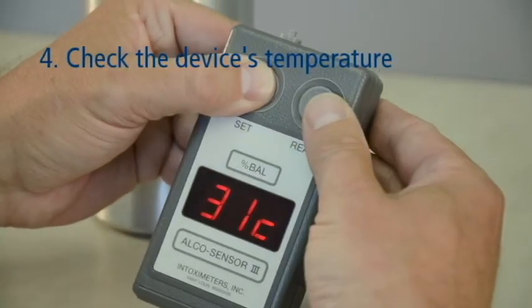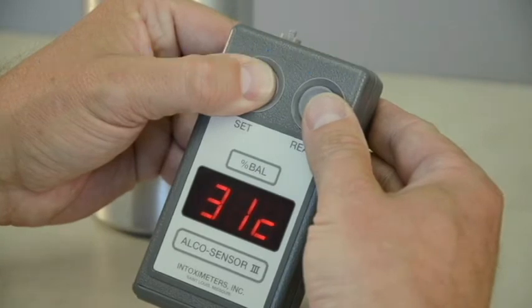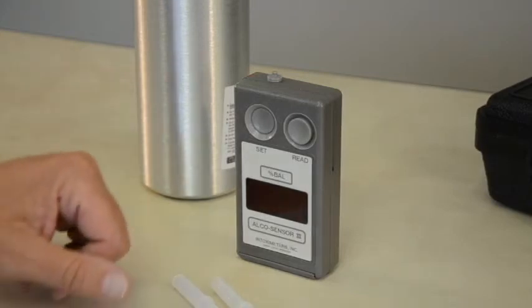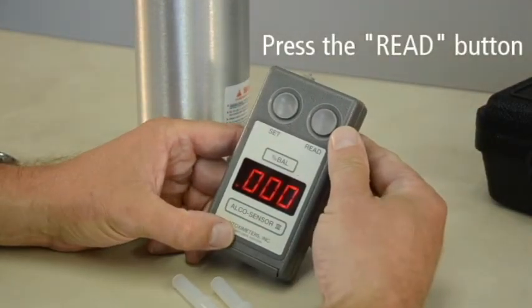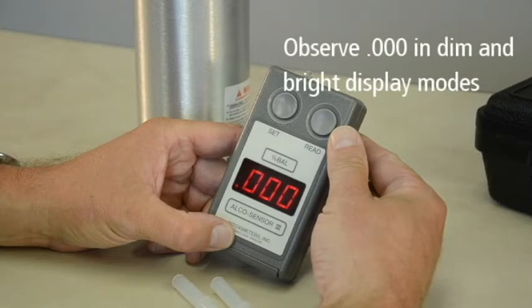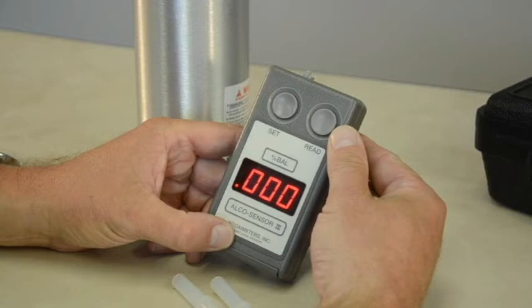Check the temperature of the instrument by simultaneously pressing both the Read and Set buttons. The temperature should read between 15 and 36 degrees Celsius. Now perform an air blank on the device. An air blank checks the device for any residual alcohol that may remain from a previous test. To perform an air blank, press the Read button only, allowing the Set button to pop up, which draws ambient air into the device. Observe the .000 reading both in dim display mode and then in bright display mode. If .000 is not seen in bright display mode, depress the Set button and repeat the air blank steps in 1 minute.